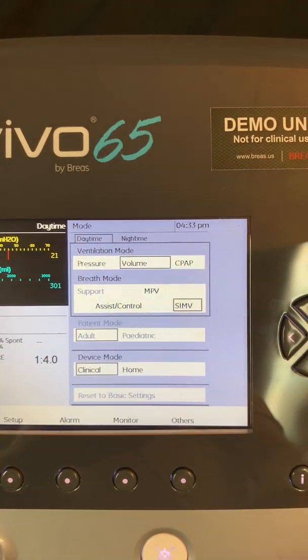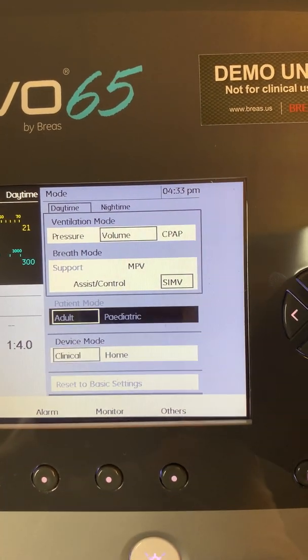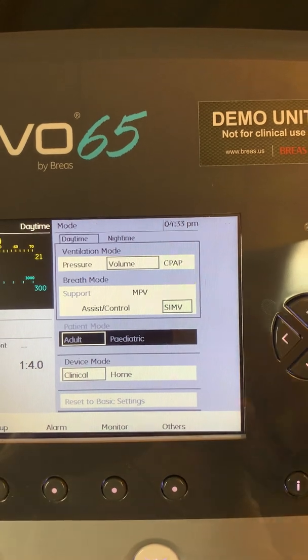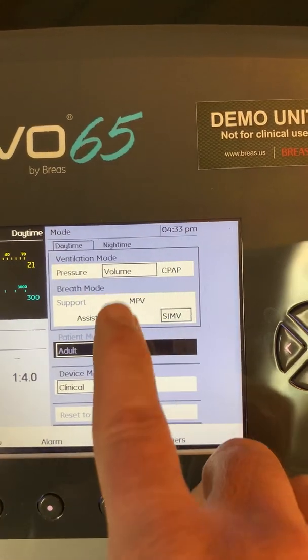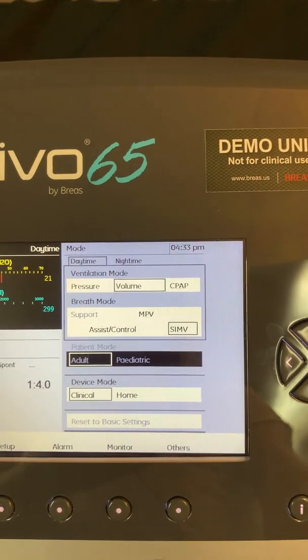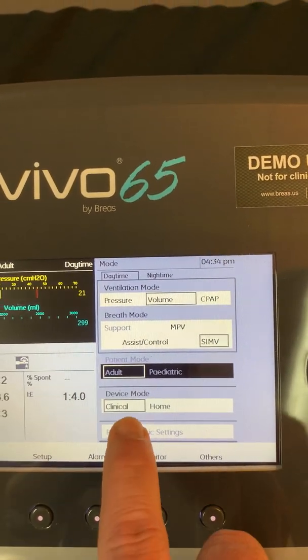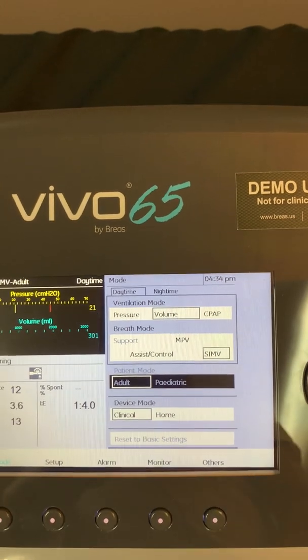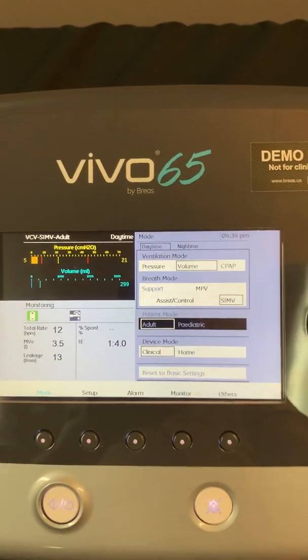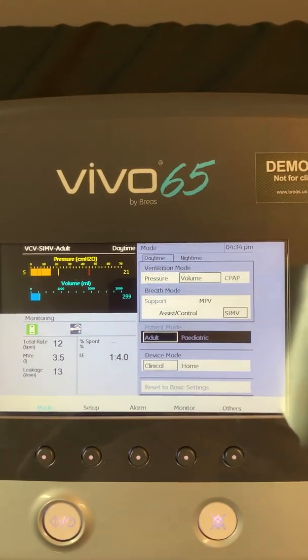So that is the mode menu. I've gone over how to make changes. I have a box around volume and a box around SIMV — that's currently the mode of ventilation I'm in. I am in the adult mode and I am in the clinical mode so that I am able to make changes. That is the mode menu and I appreciate your time. Thank you very much.